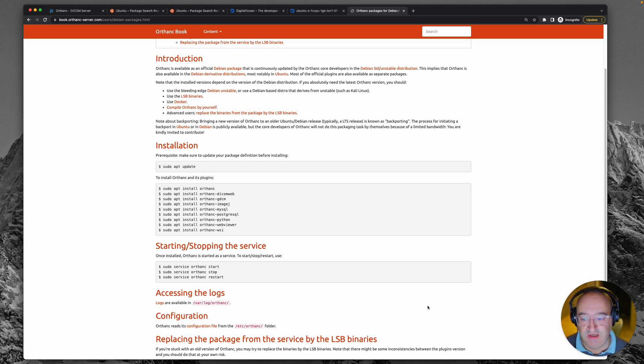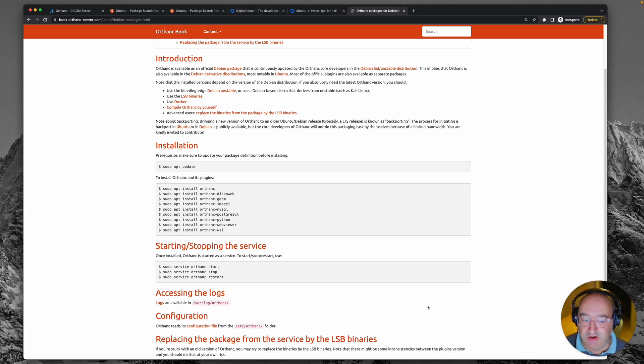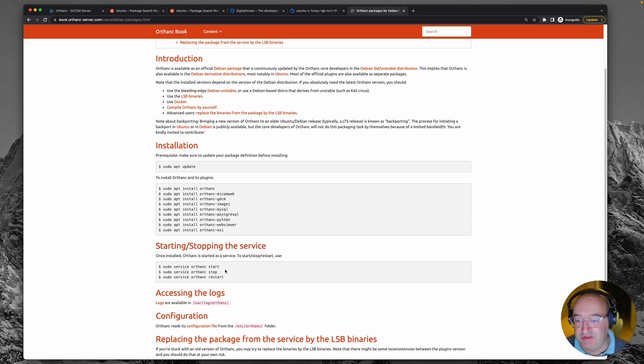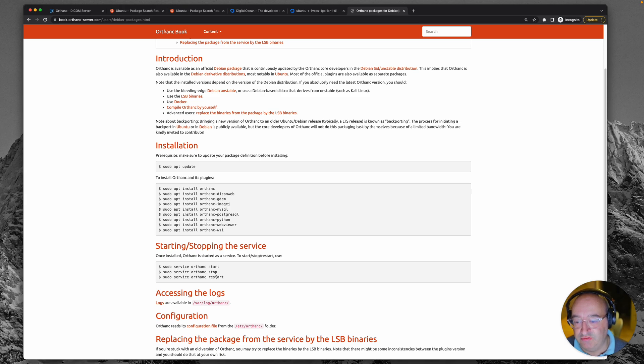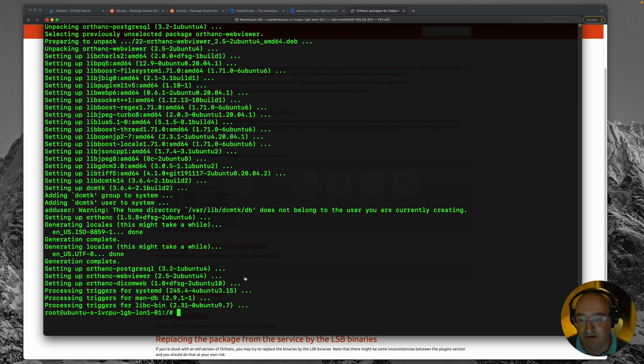I've just come back over to the website while it's doing its install because once it's in there we're going to have to curb our excitement and see if we can actually run the thing. Starting and stopping the service is what we want to do next. So we've got these commands: sudo service orthanc start, stop and restart. So we'll give that a whirl as soon as it's installed. All right, looks like it's done. So let's give that a go.